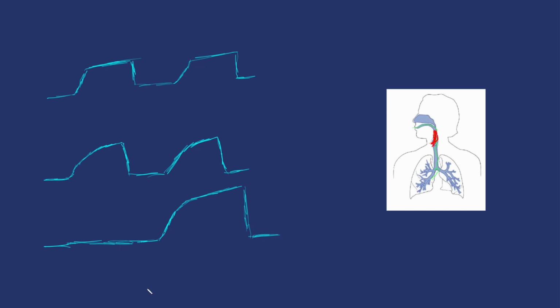Okay, and that's when we're going to see one of those physiologic responses again, as the CO2 is building up in the lungs, needs to be kicked out. So you'll see a higher end tidal CO2 in that case. So as we look at our end tidal, we'll start seeing waves that are more like this, and it'll be drawn out again and again as it's repeating.